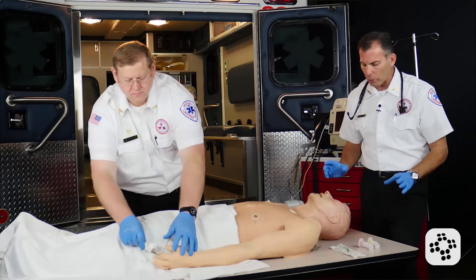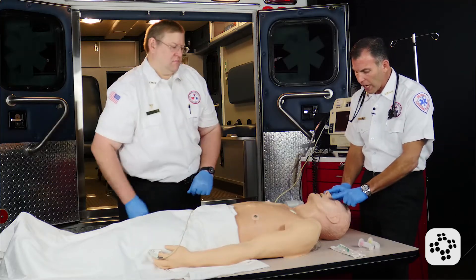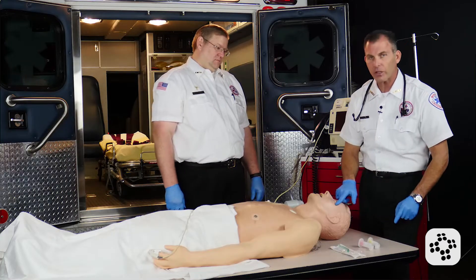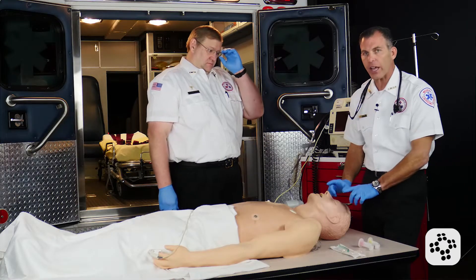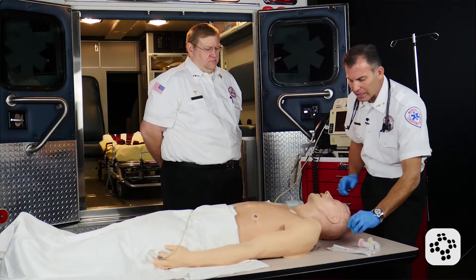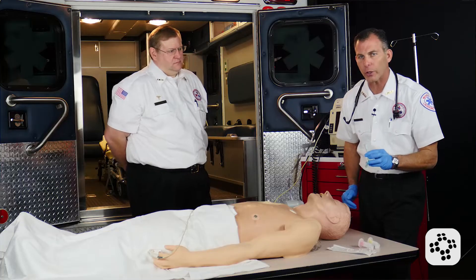Now let's talk about basic airways. In this case, the patient is unresponsive. We could check for a gag reflex by rubbing the eyelid to see if they actually have a blinking reflex — that's one little trick of the trade. If they did seem to have a gag reflex, I would opt for the nasopharyngeal airway.